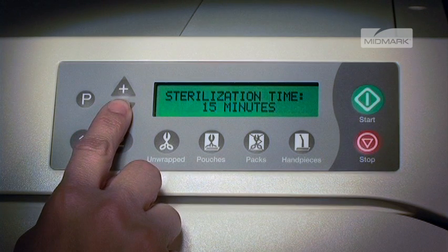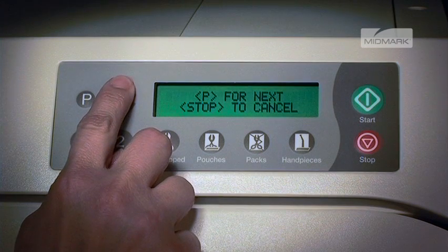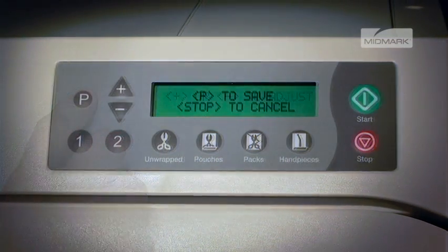When the desired time is reached, press P to store it and progress to vent type. The display will show vent type and the current value. Pushing the plus button sets it to fast vent — the vent will open fully. Pushing the minus button sets it to slow vent — the vent will open for a fraction of a second, once per minute, until the chamber is vented.